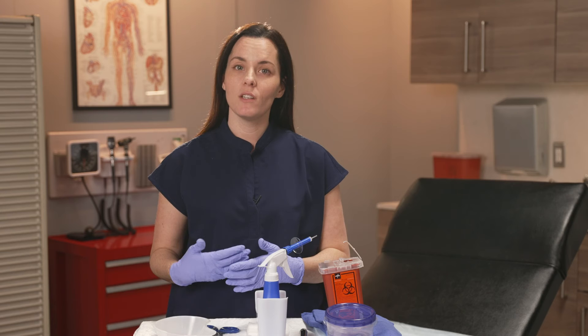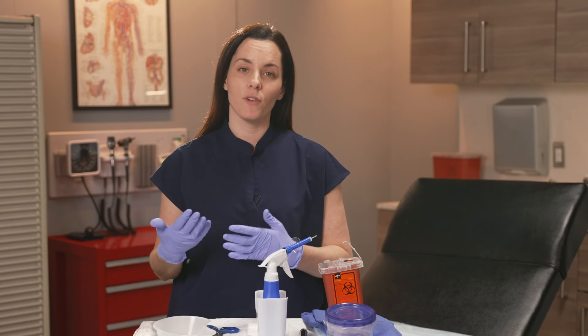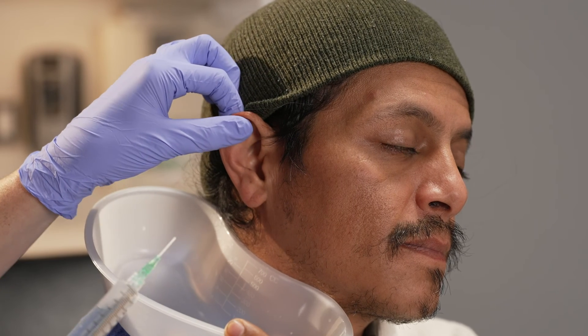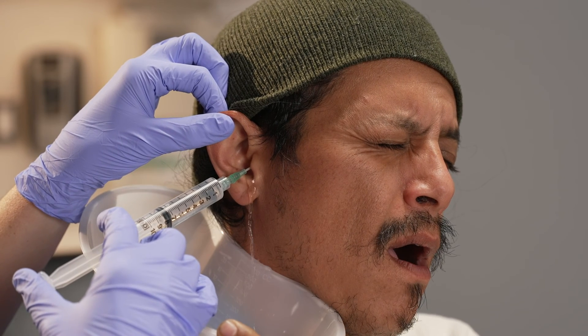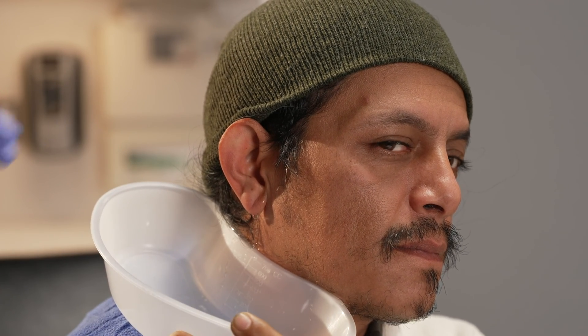If your patient doesn't have any of those contraindications, go ahead and irrigate. The patient can either be sitting or laying down, whatever is comfortable for them and for you. You're going to start by gently pulling back and up on the auricle of the ear to straighten out the ear canal. Insert the catheter tip into the ear canal, making sure not to go past the lateral third of the ear, which is about 8 millimeters in length. Direct the catheter tip upwards and begin irrigating the ear. You can periodically look into the ear to see the progress you're making, and then continue irrigating until you've successfully cleared the impaction.